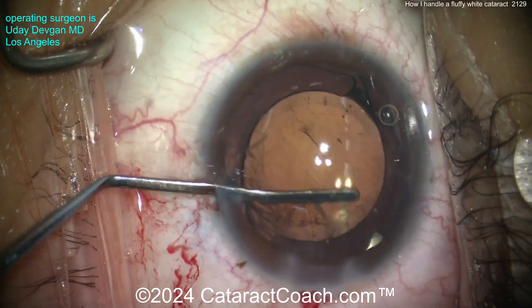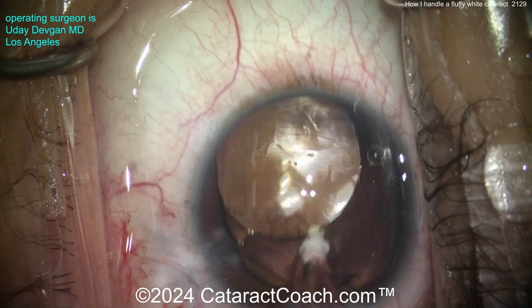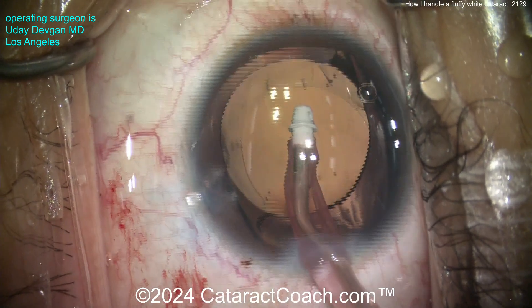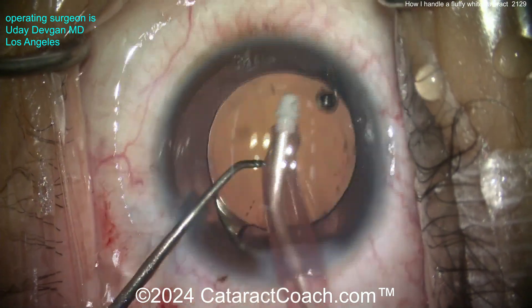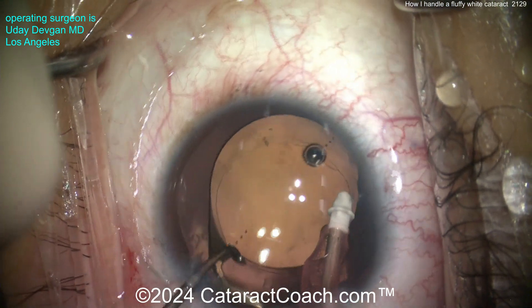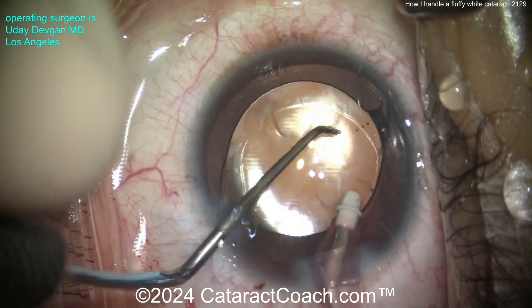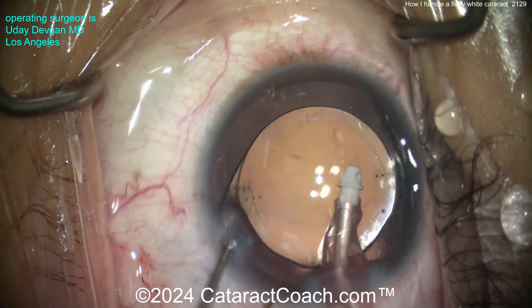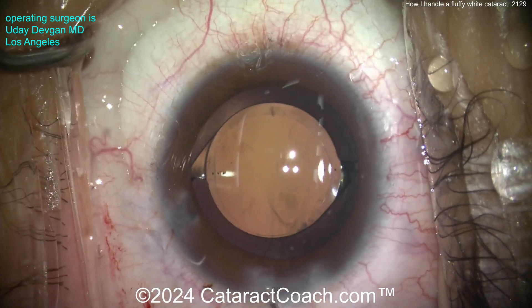Going inside with the spatula to clean up the undersurface of the capsule — getting all that adherent lens material off as much as we can. Now taking out the viscoelastic and rotating the lens into the appropriate position. Keep this in mind: if you have a young patient with a traumatic cataract that's soft, white, and fluffy — the texture of this was like cotton candy — do not go in with the phaco probe and give ultrasonic energy. That's going to break the bag and cause iatrogenic issues. Instead, go inside gently with the IA probe just to aspirate everything out. You can see we've cleaned up the viscoelastic nicely, and I get the toric lens rotated — toric marks on the cornea line up with the lens. That looks fantastic.